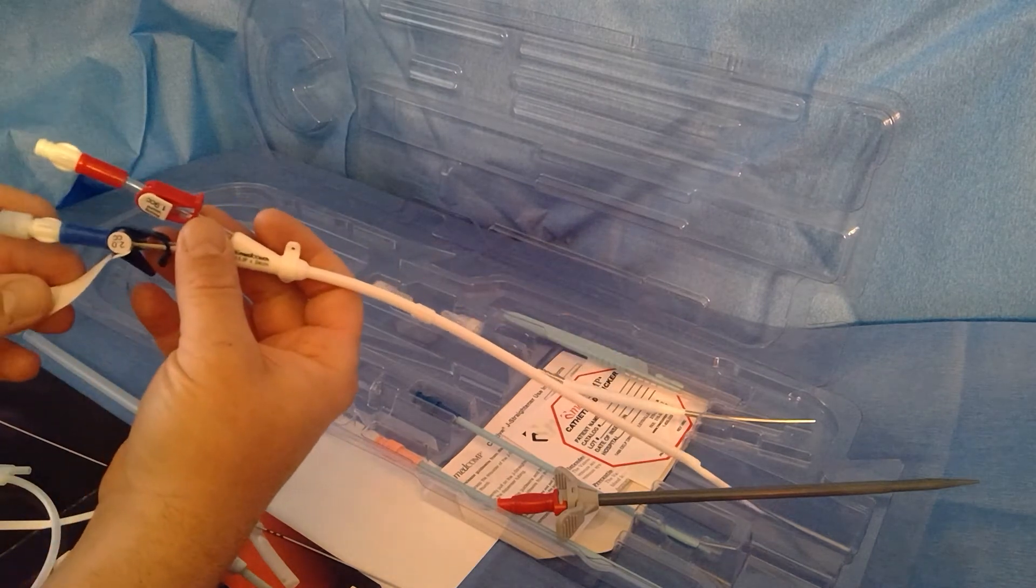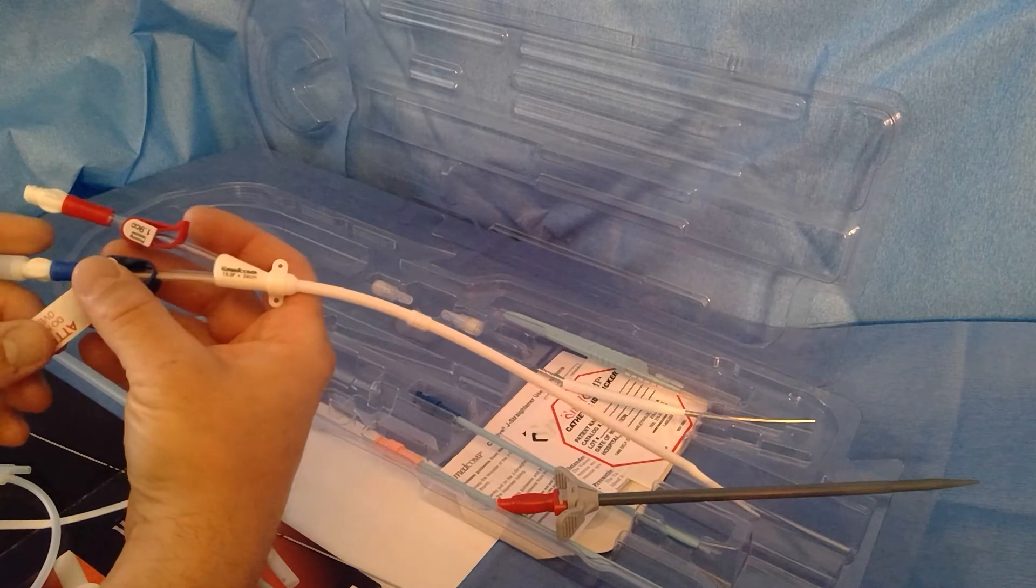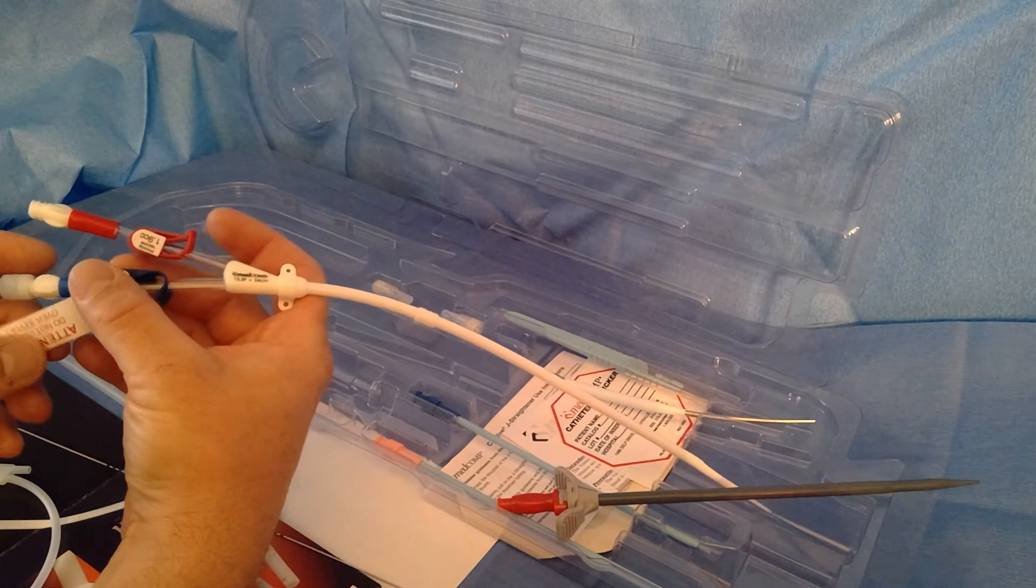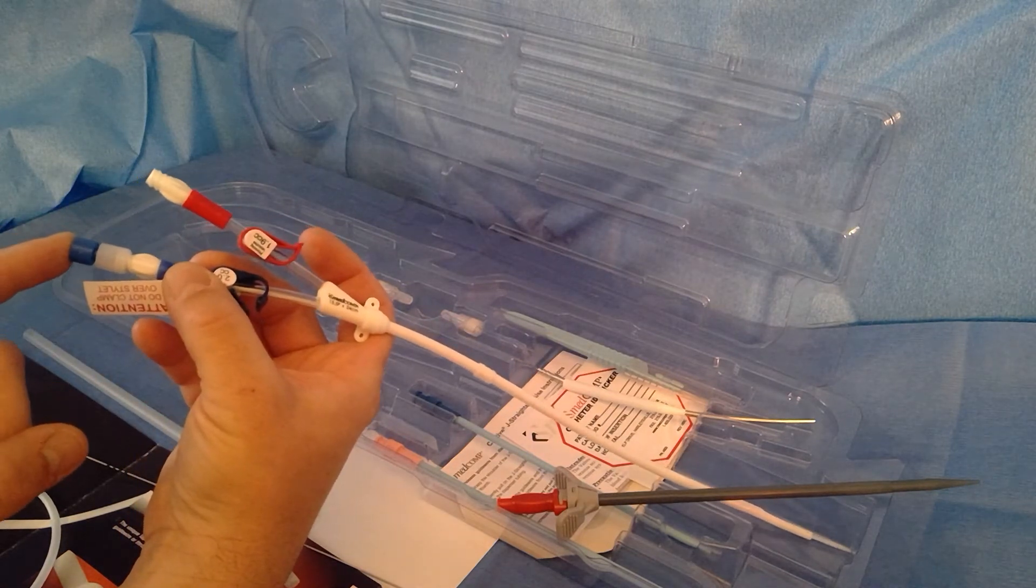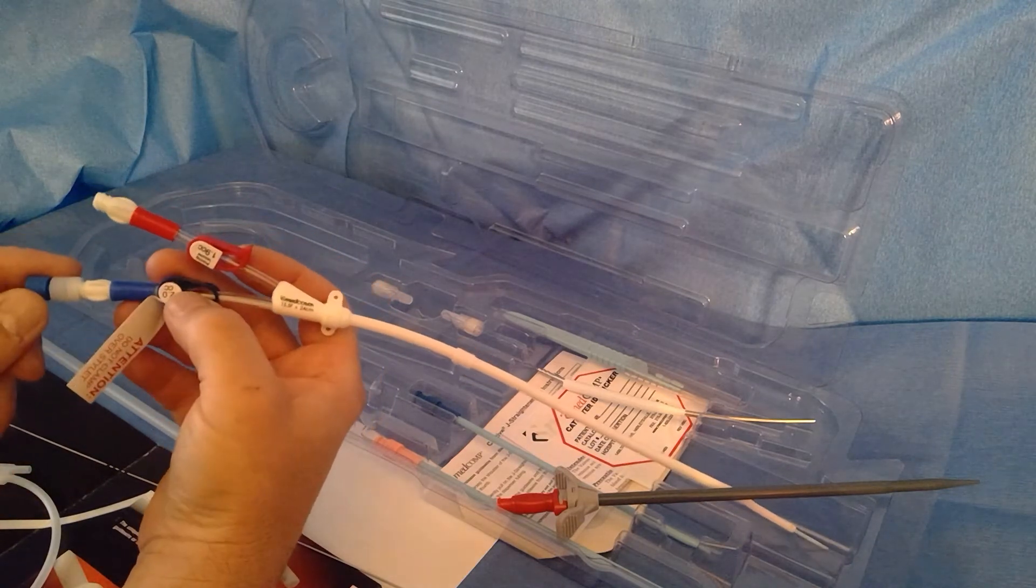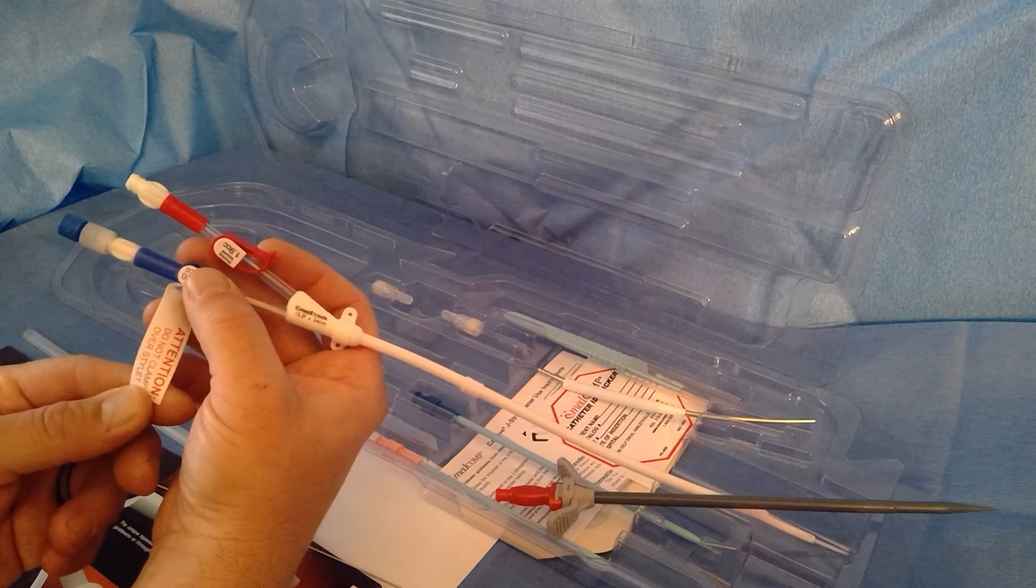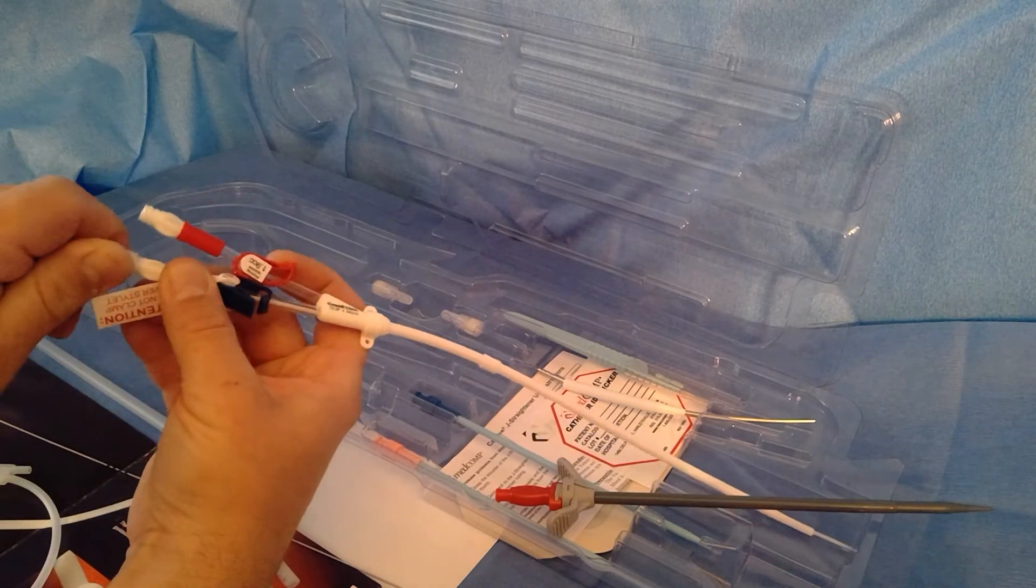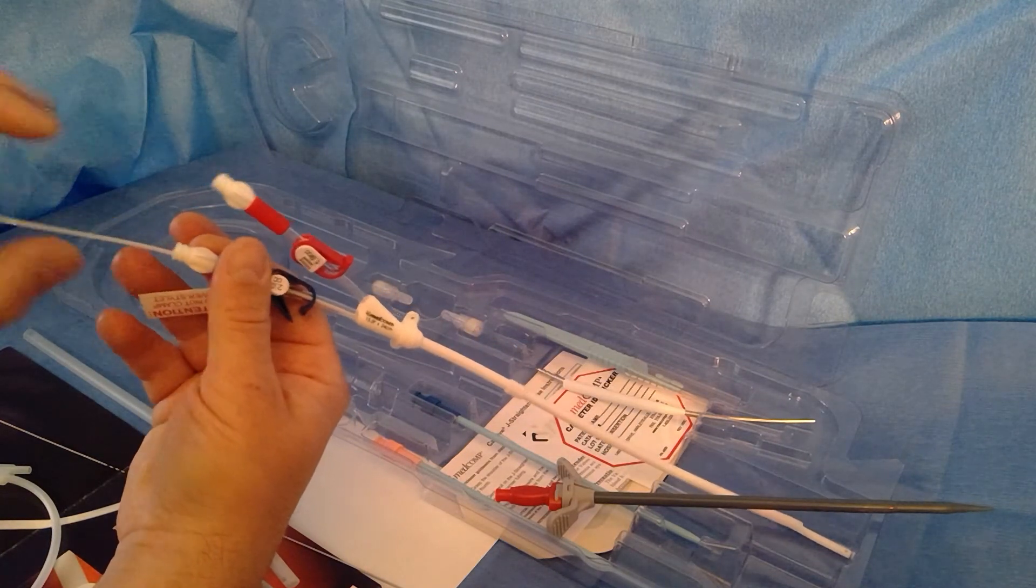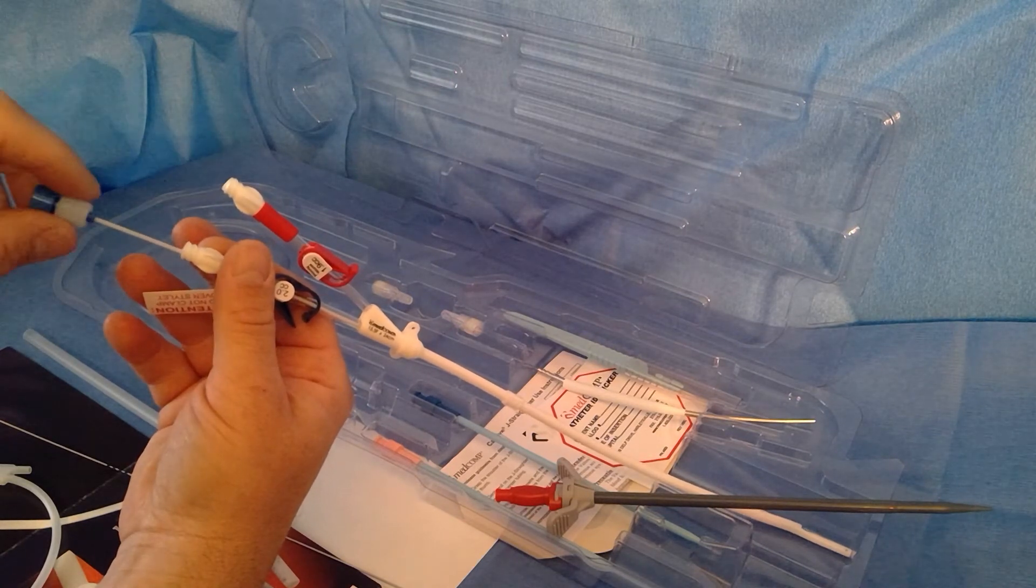The catheter has your usual red and blue lumens with the priming volumes on the clamps. One thing unique to this Titan, as well as some of our other Medcomp catheters, is it comes with a stiffening stylet or a fast track stylet that helps aid in exchanges. On this catheter it's through the blue lumen. It has a little label here that says do not clamp over the stylet. The reason being is this clear plastic stylet can be kinked with this clamp, and if it gets kinked then it'll be harder to get the wire through during the exchange.